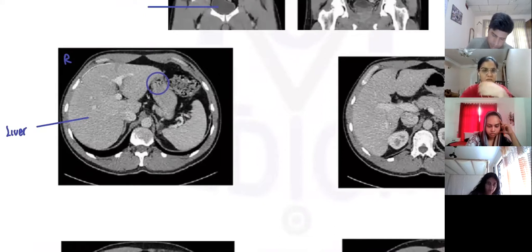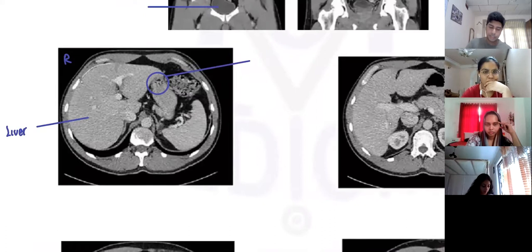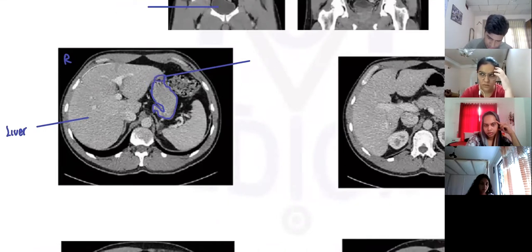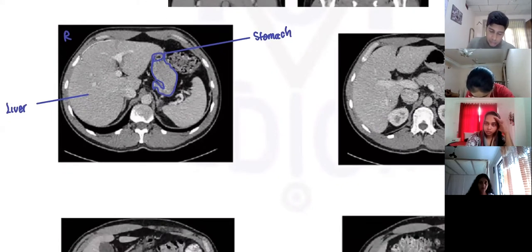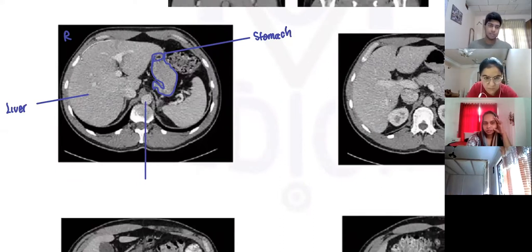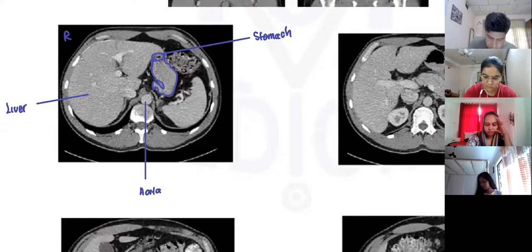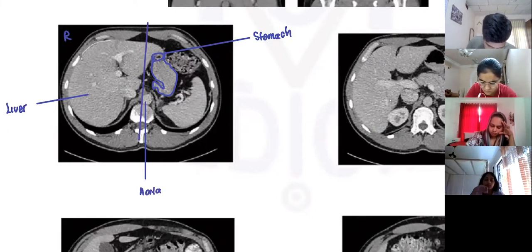Can someone tell me what this is? It's on the left side, look at the shape. You can see something here - it's the stomach. When reading abdominal CT scans, first you find the liver, then you find this structure - the aorta. Remember it is slightly to the left of the body. You can see here if this is the midline, the aorta is slightly towards the left.